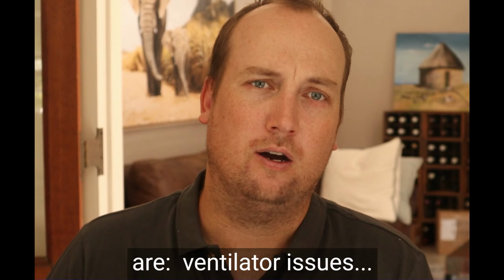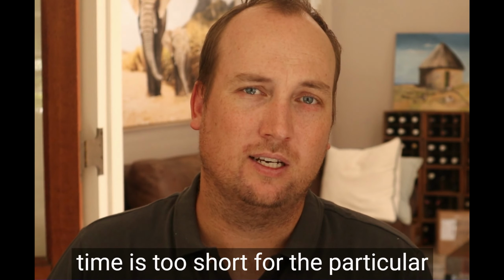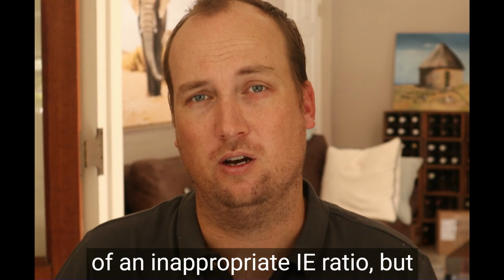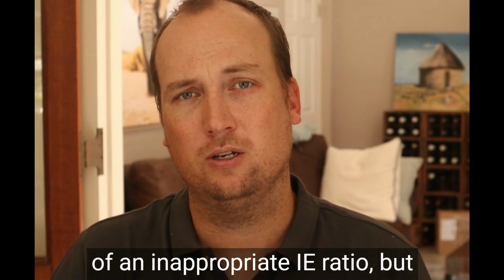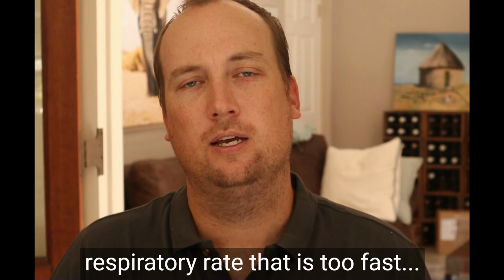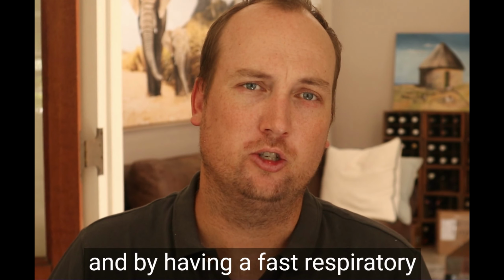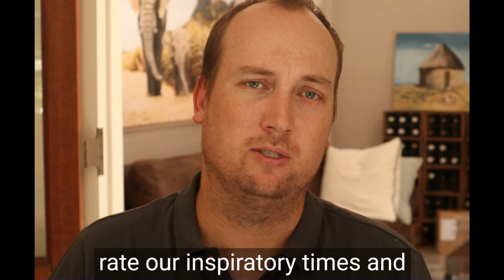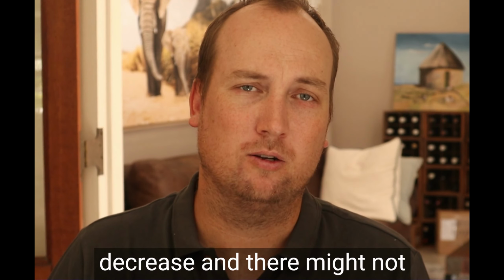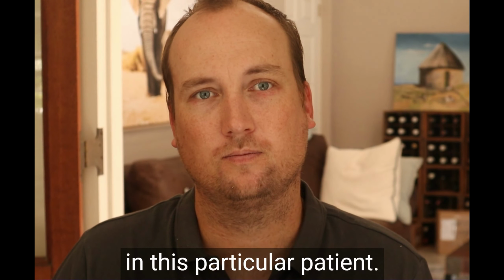Then other causes are ventilator issues. So this can be if our expiratory time is too short for the particular patient, and this may be because of an inappropriate IE ratio, but it also occurs when we dial in a respiratory rate that is too fast. And by having a fast respiratory rate, our inspiratory times and expiratory times proportionally decrease, and there might not be enough time for exhalation in this particular patient.